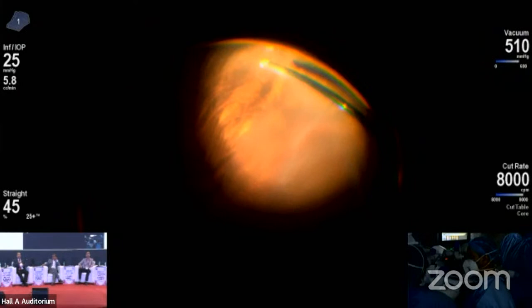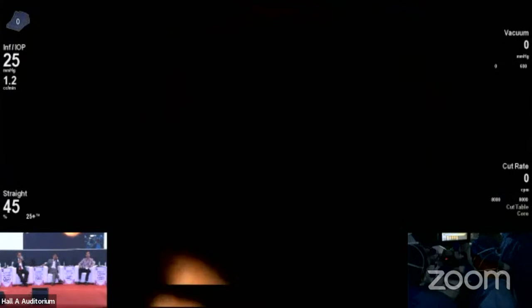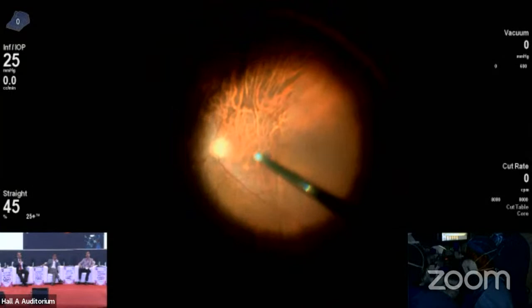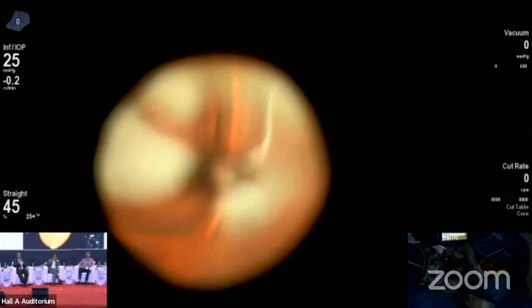So since the patient is a high myope and it appears that PVD is present, I'll still double check it with the help of triamcinolone once. So you just need a little bit of triamcinolone at the posterior pole, just a few crystals over the disc, and then we go in with the cutter.